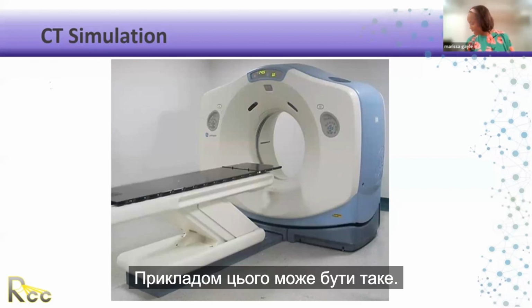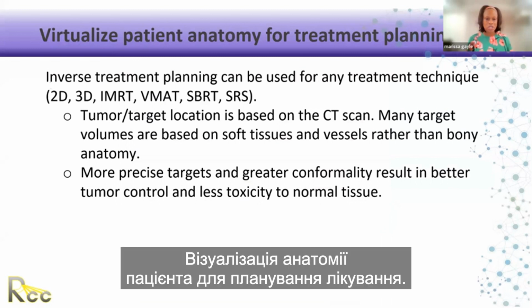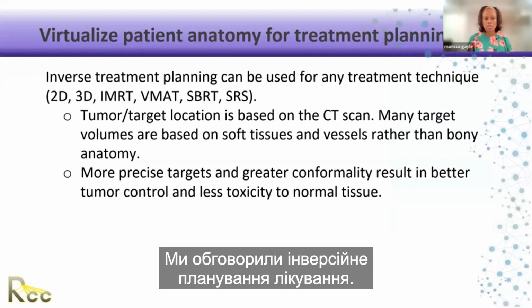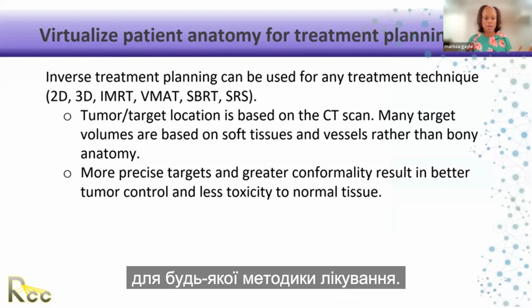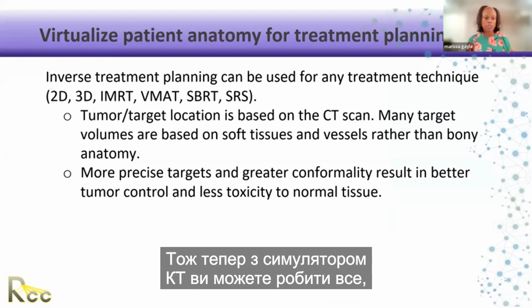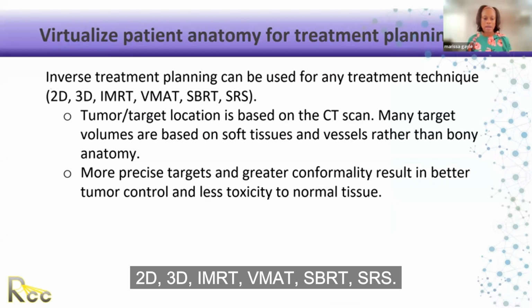An example of that would be visualizing patient anatomy for treatment planning. Inverse treatment planning we discussed. So inverse treatment planning can be used for any treatment technique. So now with a CT sim, you could do whatever you desire: 2D, 3D, IMRT, VMAT, SBRT, SRS.